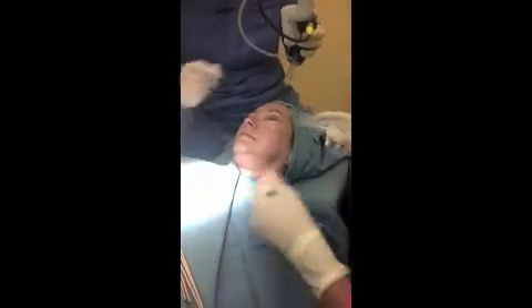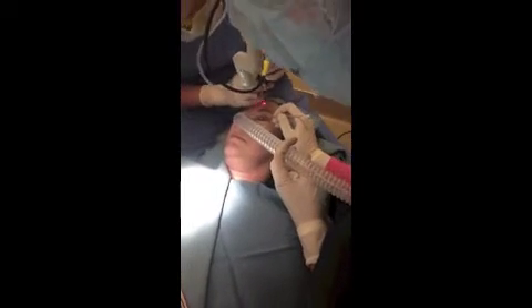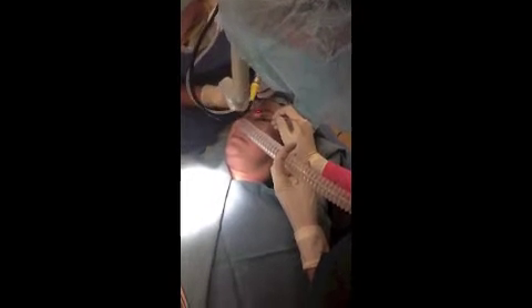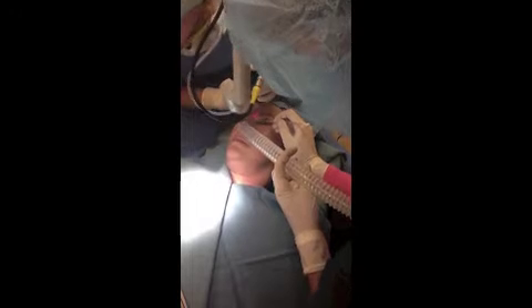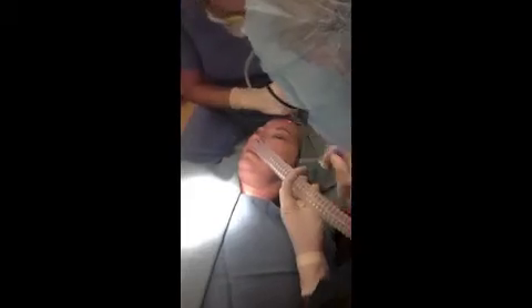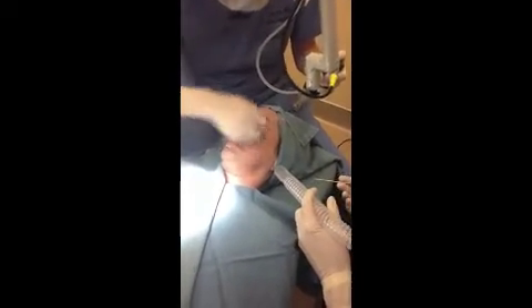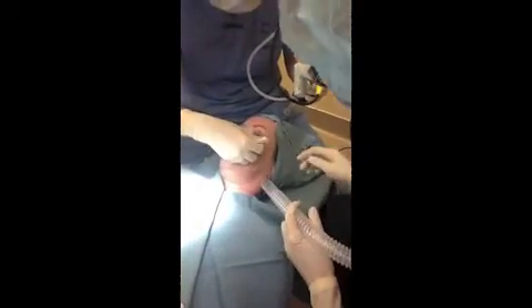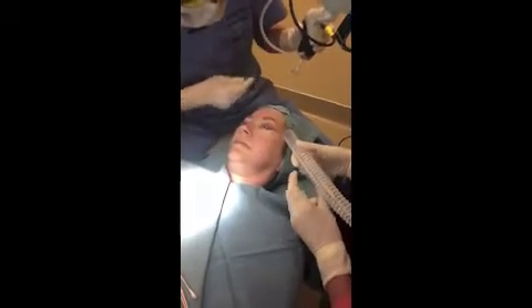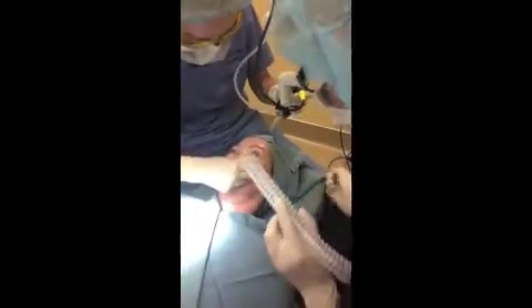Let's see, Mary, can you get the little one? And then I'm going to do the under and then I'll go back with a really small one to go under the eyebrow. Lisa, try to look up to the back wall for us, see if you can do that, just with your eyeballs. There we go, that's perfect.